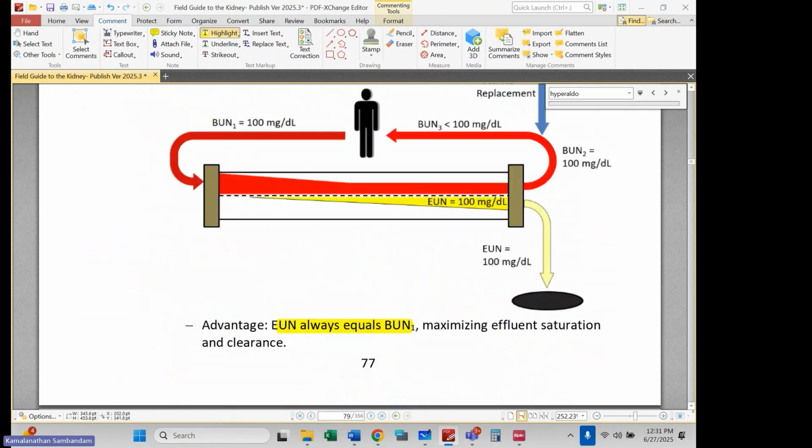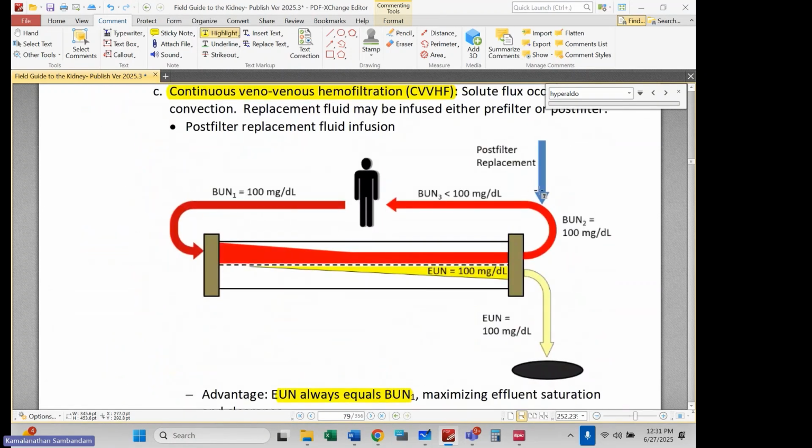Looking at this figure, again, in post-filter hemofiltration, you do get net hemoconcentration, right? My hematocrit here is 30%. I'm pushing fluid across that membrane, maybe at 20 cc's a minute. My hematocrit here will indeed be increased to 35%. I am getting hemoconcentration and a predisposition to clotting.